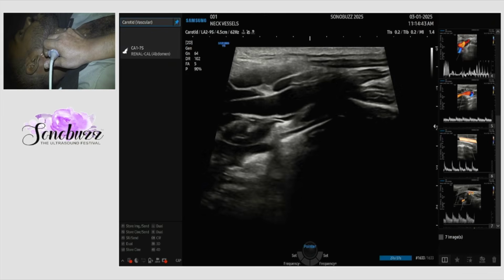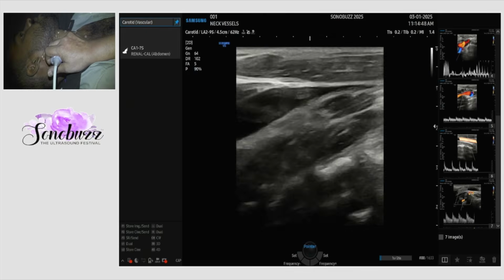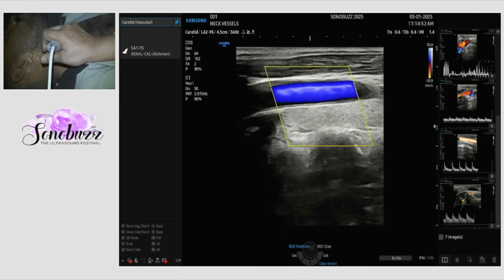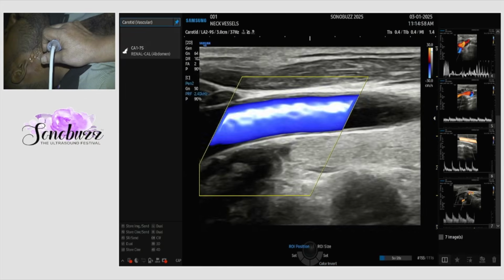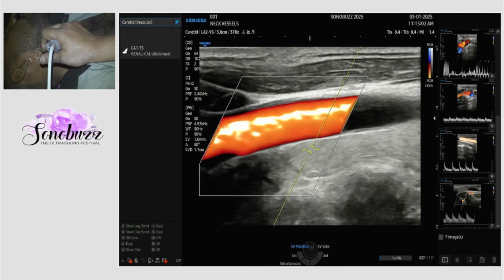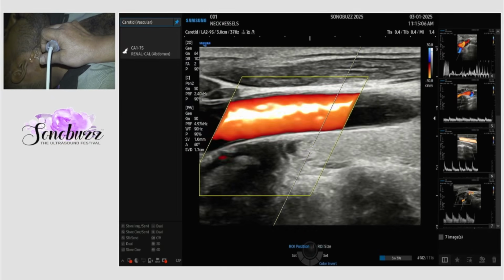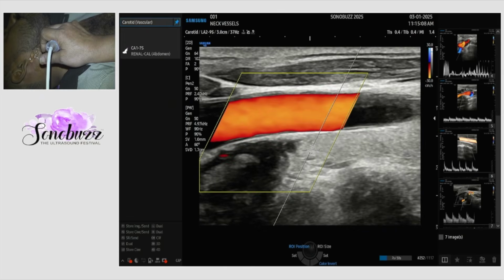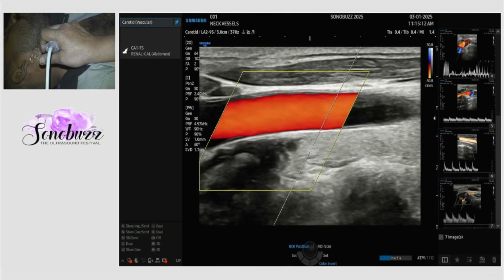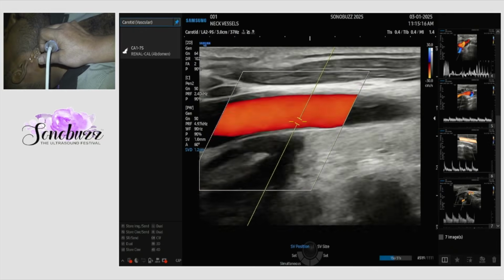While taking the velocity, it is better to not use the wide view, so we'll switch it off and switch on the color, get the image in the center, and convert it for better viewing. And then this is LumiFlow. If you want, keep it on, or if you want, you can remove it. It depends on your personal liking. I prefer without LumiFlow.